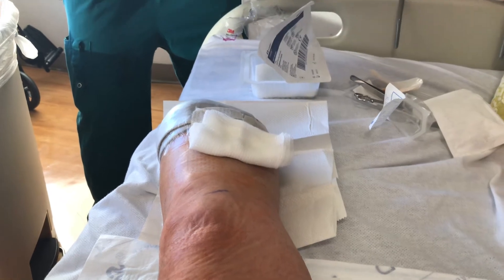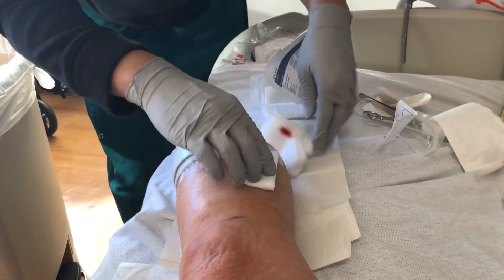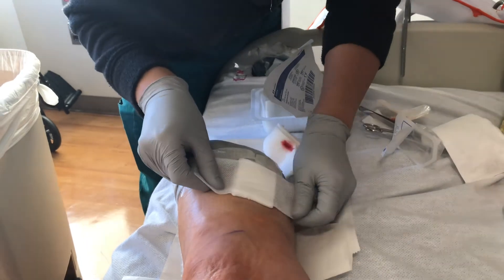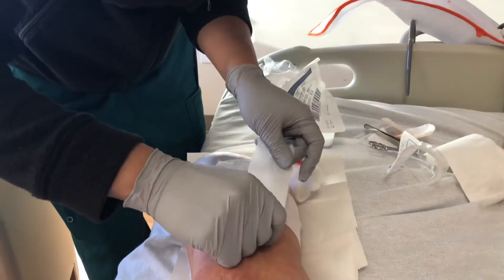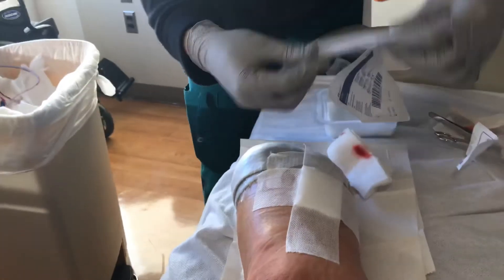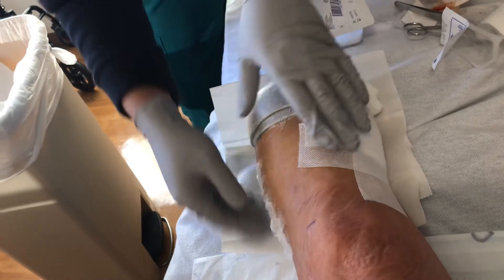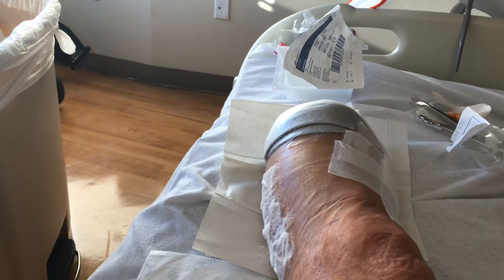So — shrinker 23 hours. Keep on doing all those flexes and all that. What's all that on there? This is just some cotton right there — I can try to wipe it off before you go in the shrinker.